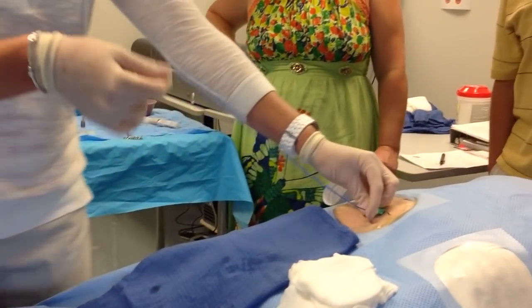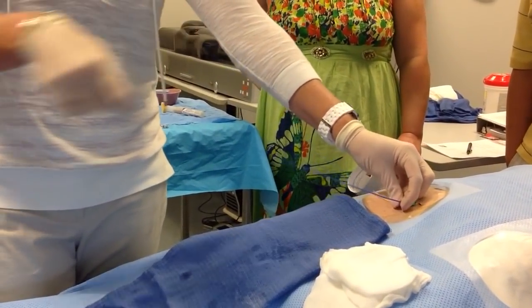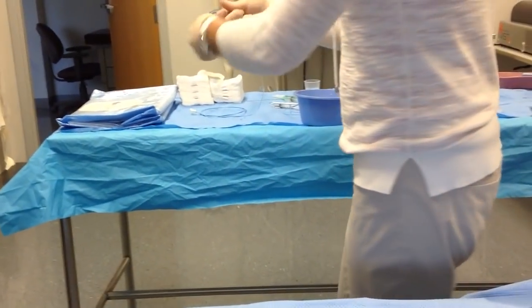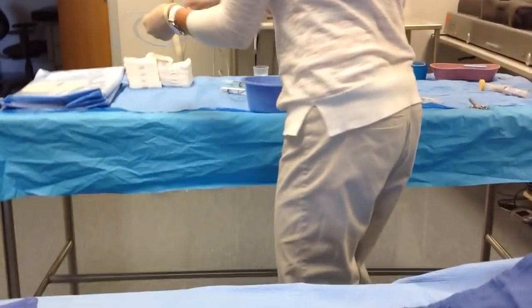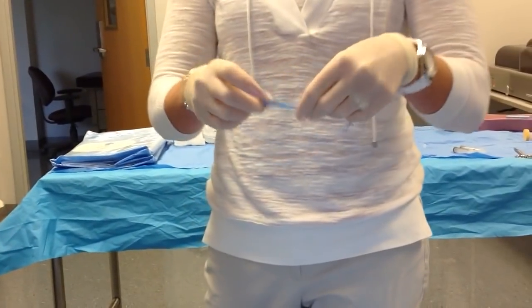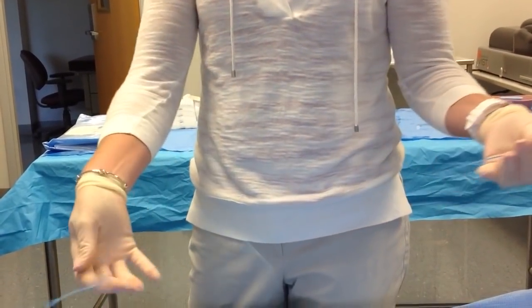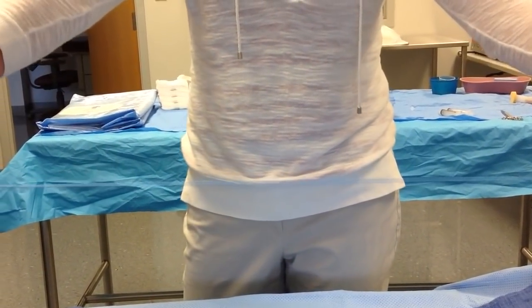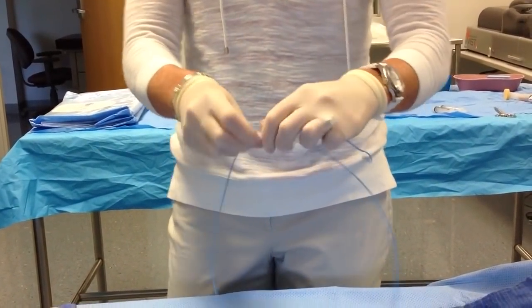So now, I'm just going to take this out now instead of doing over the wire. So sometimes they just pull the catheter out. And then you get your pigtail. Gosh, I have these all. I don't like having them in like that. I like mine like out like this, so you can grab them easier.